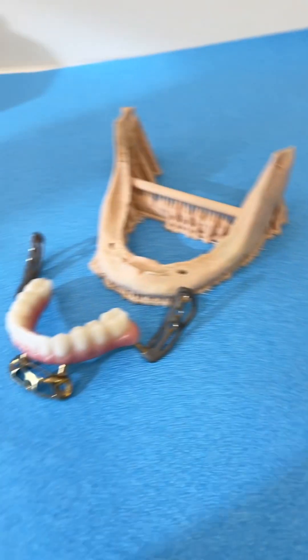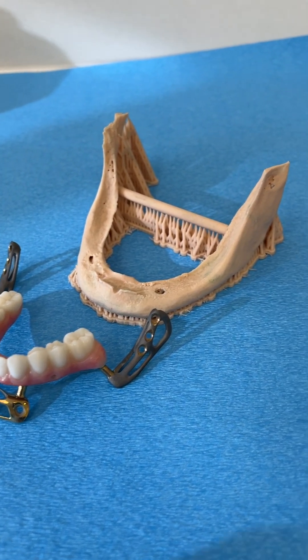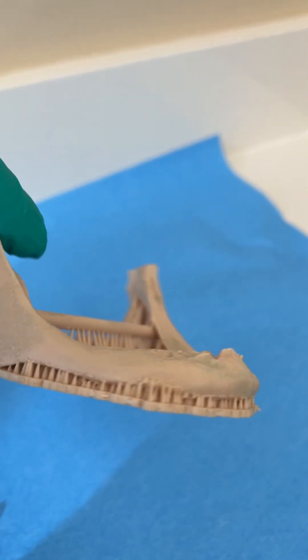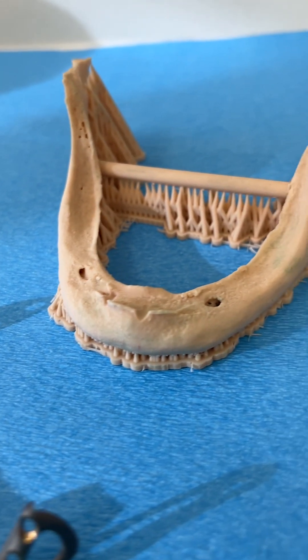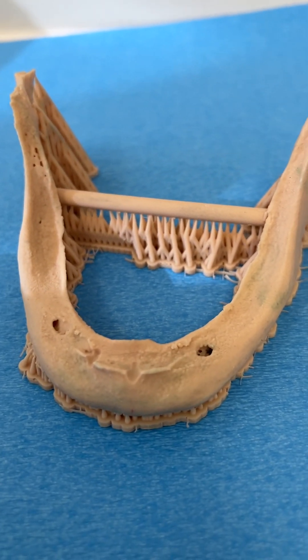It's a custom metal frame that has teeth on it, and this patient's jaw is very, very thin. This is a 3D printed lower jaw, and you can see the patient's jaw is thinner than my pinky. You can't drill implants into this jaw or the jaw will break. This is also where the nerve chambers are, where the nerves come out from.